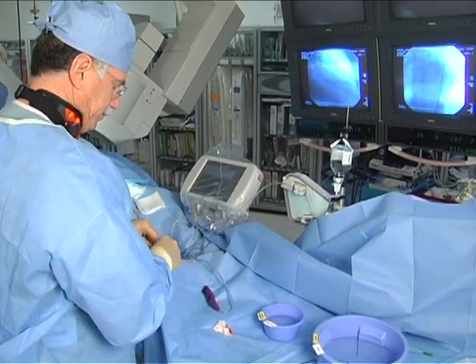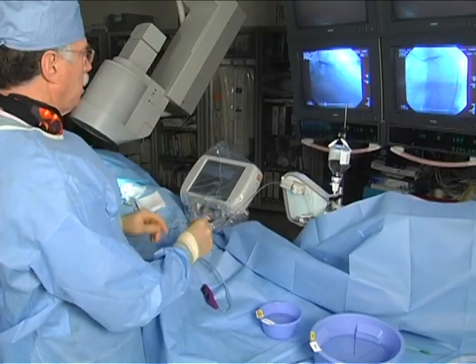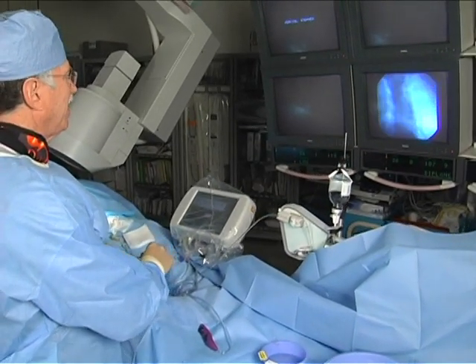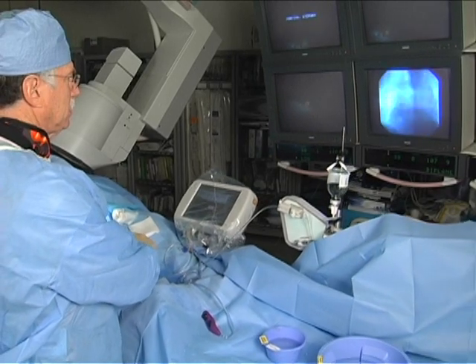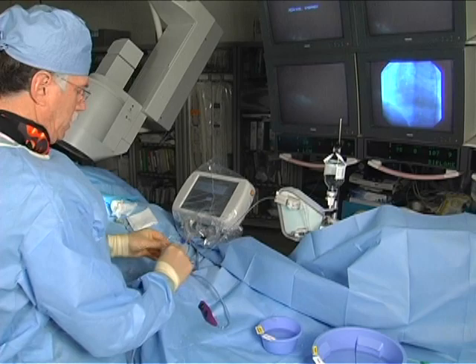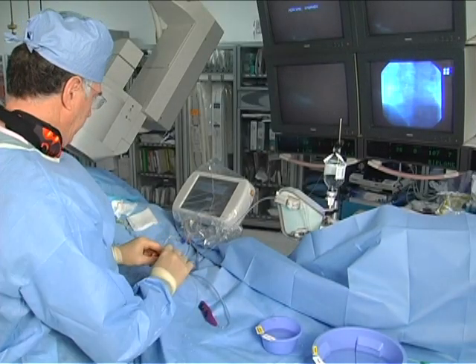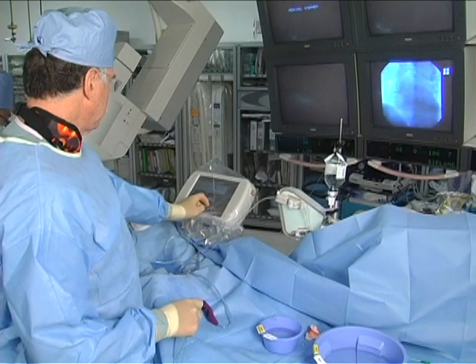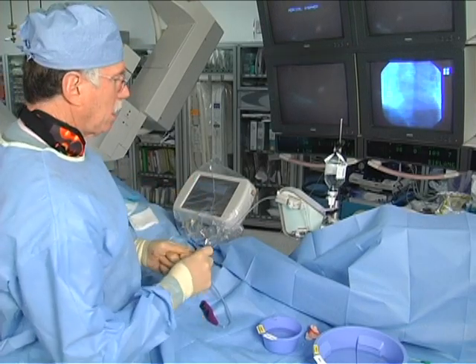Wire's up. Follow the wire. Easy. Go ahead. Very good. Okay, wire's out. Go ahead and hook up. I'm going to change to the RCA setting. Okay.